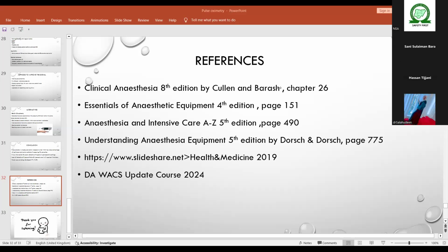to, that's why I said just the way you put your Doppler. In this instance, you're saying they go through the ETT, just to get it. It's not that it will be placed there. It can't do transmissional pulse oximetry. So it's reflectance, it will reflect and backscatter, so you get your reading. If you take it out of the ETT so that you can continue the main reason why you put the ETT there, which is for oxygenation and ventilation.